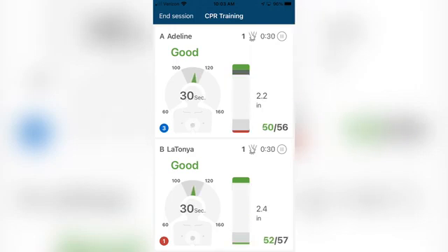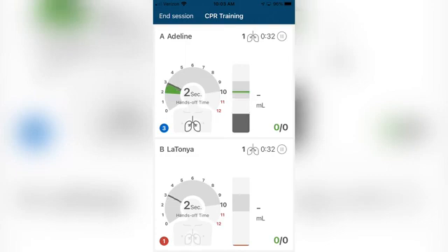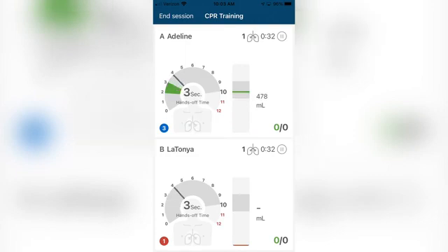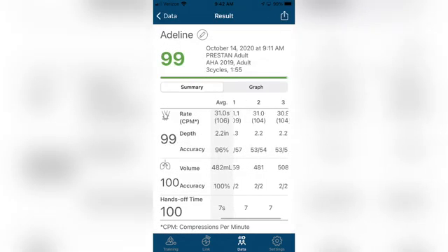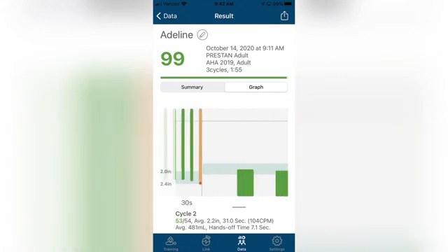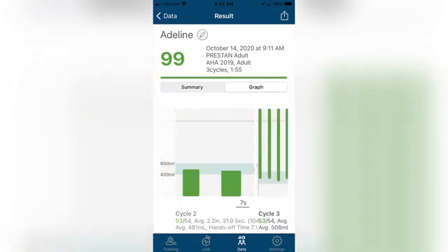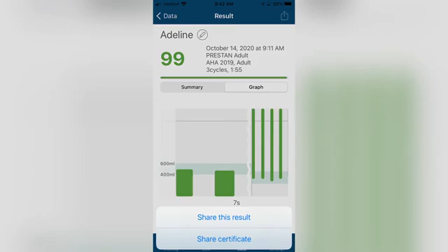The Preston CPR Feedback App allows instructors to provide comprehensive CPR training while monitoring CPR performance for up to six students at a time. This app is also equipped with a reporting feature that allows for CPR training results to be shared, downloaded, or printed directly from the app.